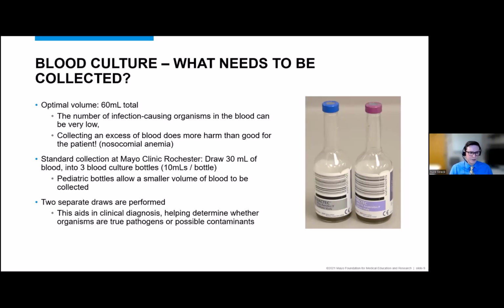Relative to other blood testing that might be performed in these patients, we're really looking for a relatively large amount of blood to perform this testing. There have been a number of studies that have looked at the performance and sensitivity of blood culture testing, and adequate volume starts at about 40 mL of total blood collected. We can detect the majority of bloodstream infections, but we can increase the sensitivity of testing, particularly in certain at-risk patients, if we get closer to 60 mL of blood.